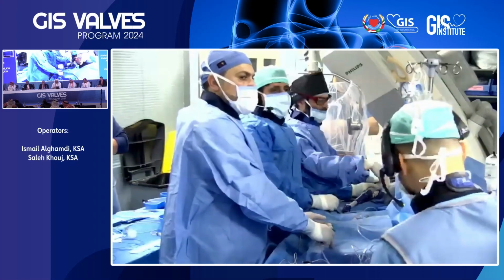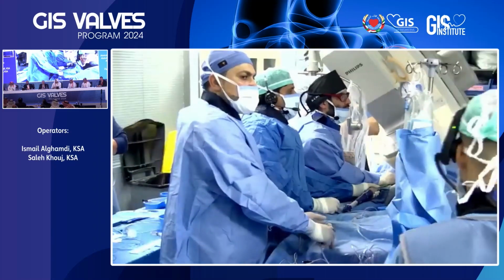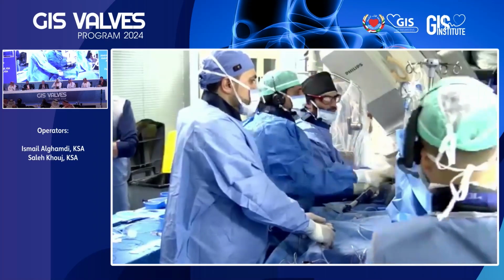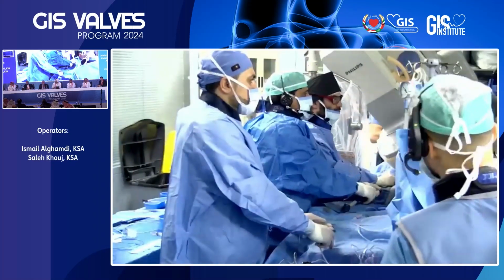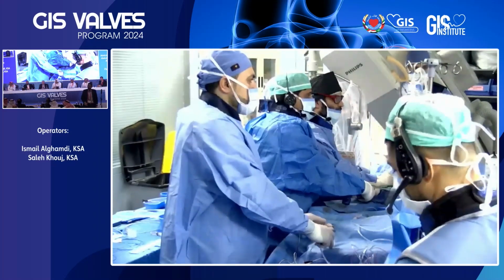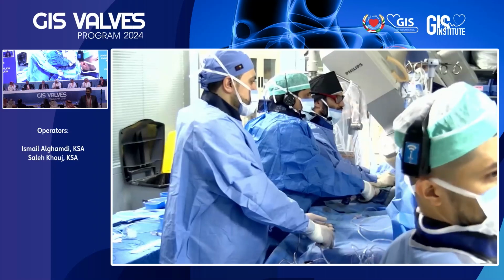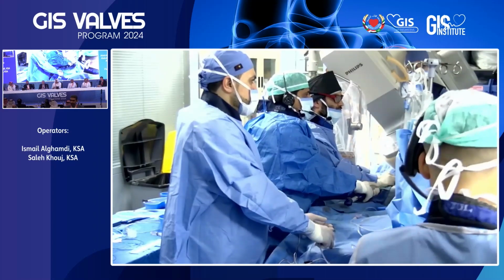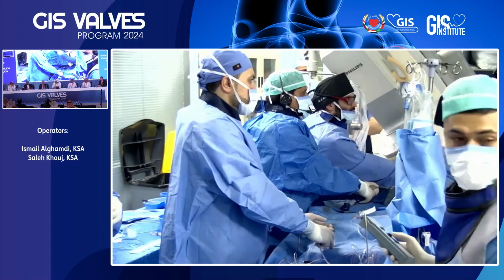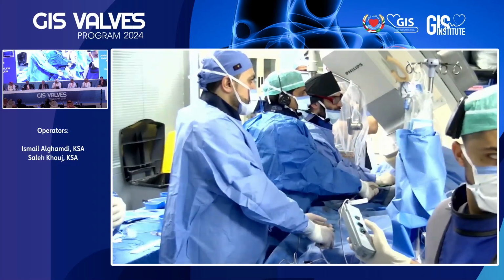Ziad, please. Slowly. Don't press. Stop. Slowly. So now you're deploying. Can they move the camera from the direction of the hand to the screen? Who's holding the camera?